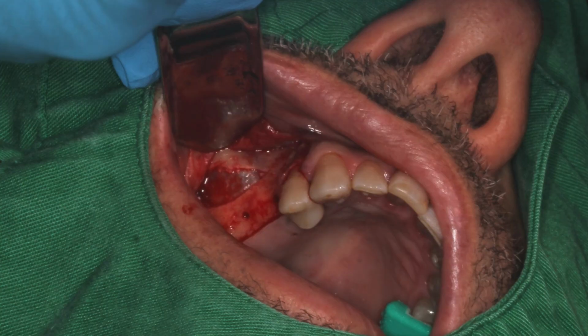So here we are now that the window was lifted. You can clearly see the outline. And this photograph particularly shows a good use of the Minnesota retractor.